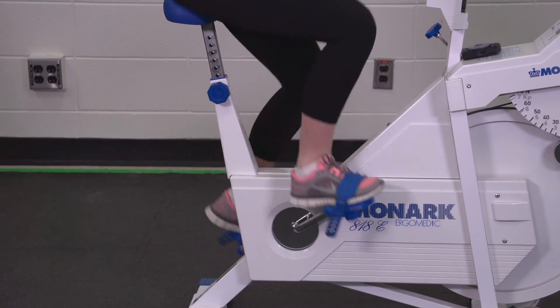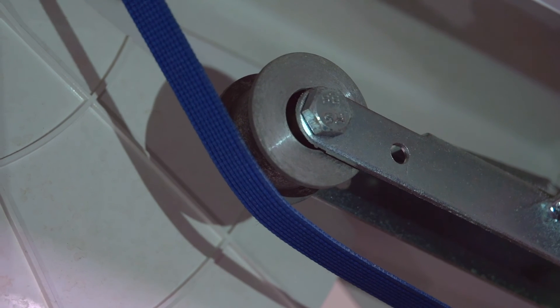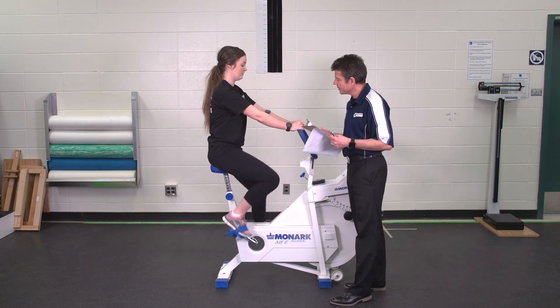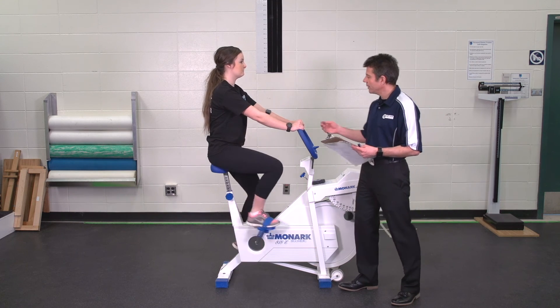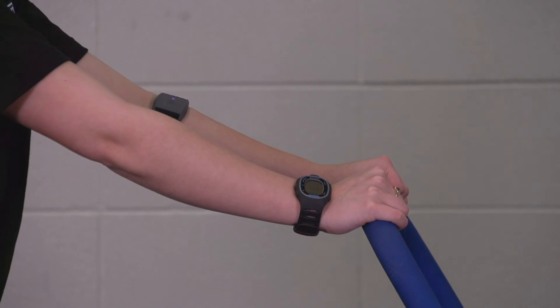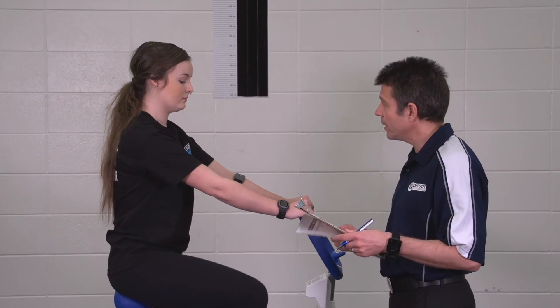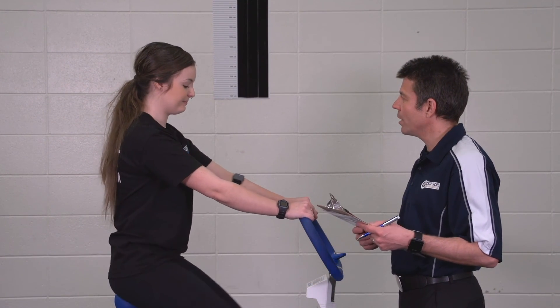You just keep pedaling — you can pedal at whatever rate you like, nice and comfortable. We'll do this for three to five minutes. Alara, we're one minute into the active recovery — I'm just going to check your pulse. Alara, two minutes into the active recovery — check your pulse. Three minutes into the active recovery — I'm going to take your pulse, and that's coming down nicely. So if you're feeling all right, you're free to stop. But if you'd like to continue the active recovery for a couple more minutes, you're more than welcome.